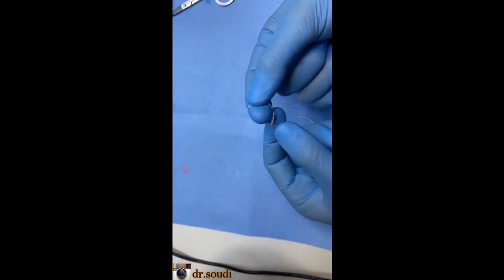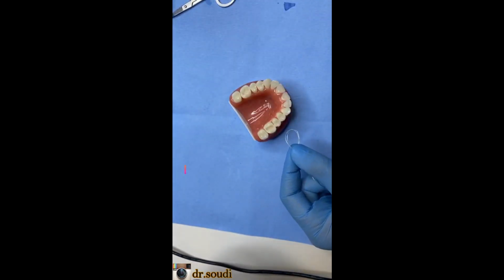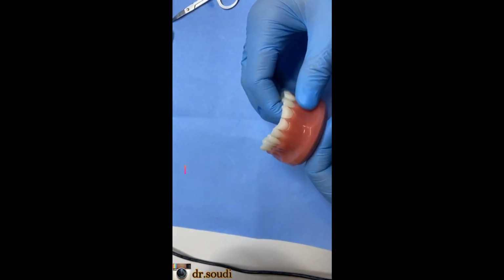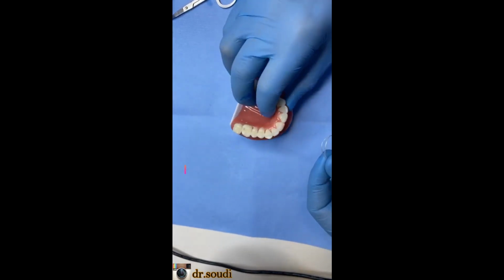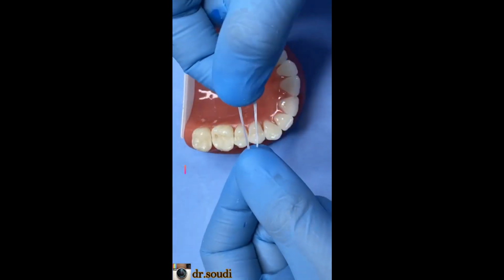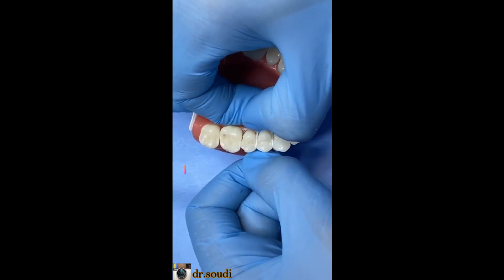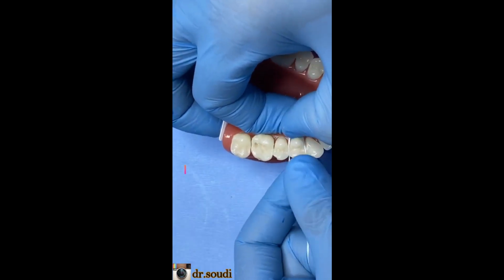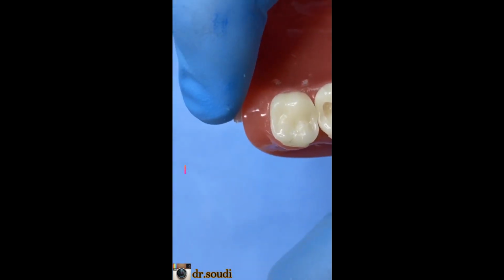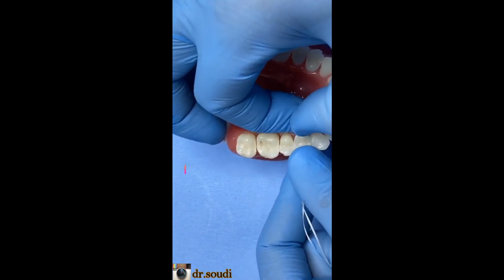How will we place it? Now we have two ties. When you place it in a molar or anterior, let's place it. I have prepared the two teeth for anterior composite one, so be ready for an anterior one. So how will I place it? I open it, place it between contact first, like this. It's down. Yes, it's down. Press it, pass it between the contact.